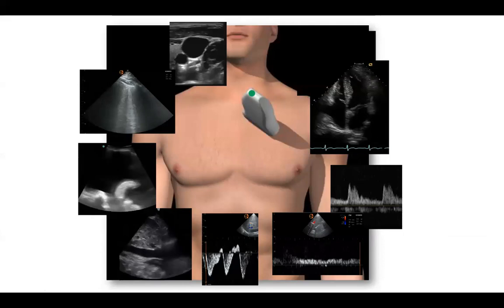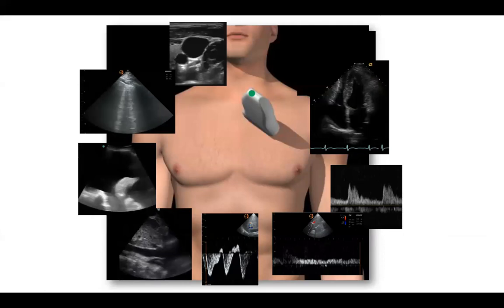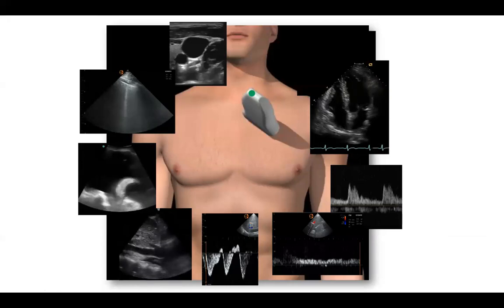Cardiac ultrasound is not enough in these patients. You have to use lung ultrasound. You have to learn how to use systemic venous congestion assessment by VExUS, which is not difficult. For cardiologists, this is a very easy tool to learn because you already have the skills for ultrasound. And once you perform this pyramid of point of care ultrasound, you are more comfortable and more confident that you are not missing something important.